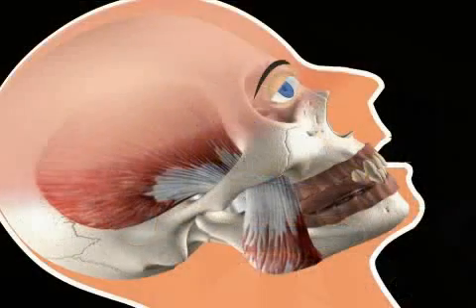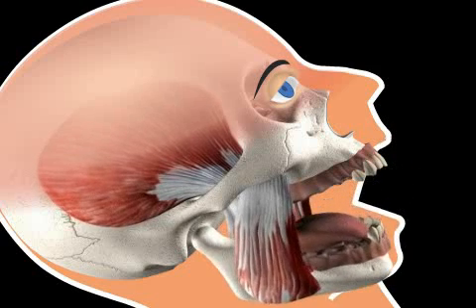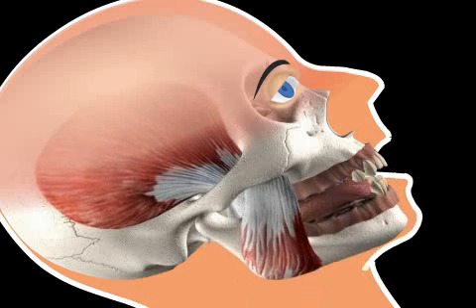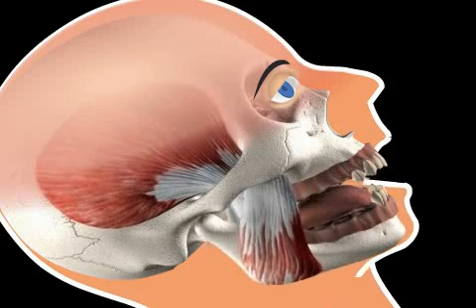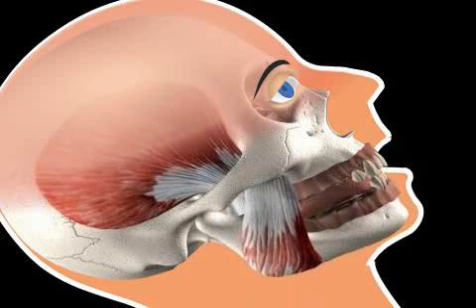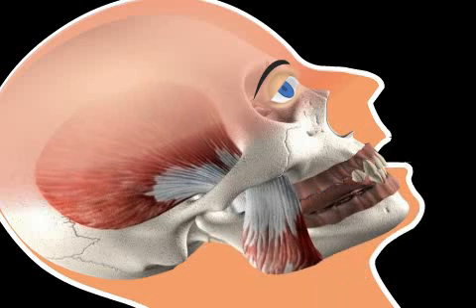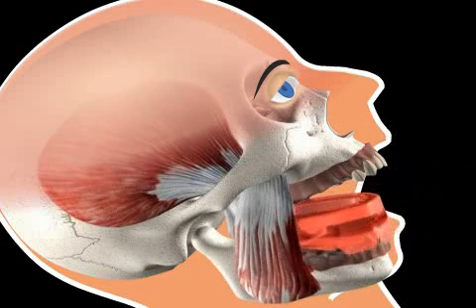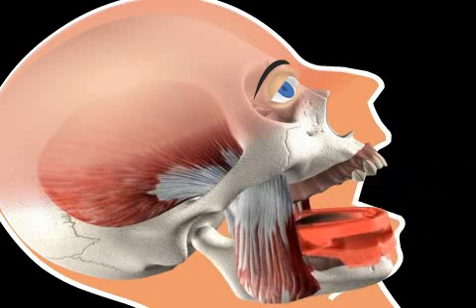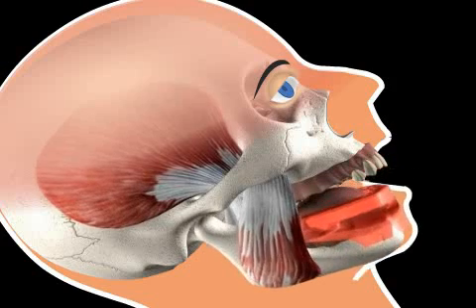As soon as the dentist receives the bite templates from the technician, the patient visits the dentist a second time so that his bite can be taken. The dentist places the bite template in the patient's mouth. Bite templates can be produced for both lower and upper jaws, depending on the remaining teeth. The patient bites carefully, thus creating impressions in the wax wall of the bite template.